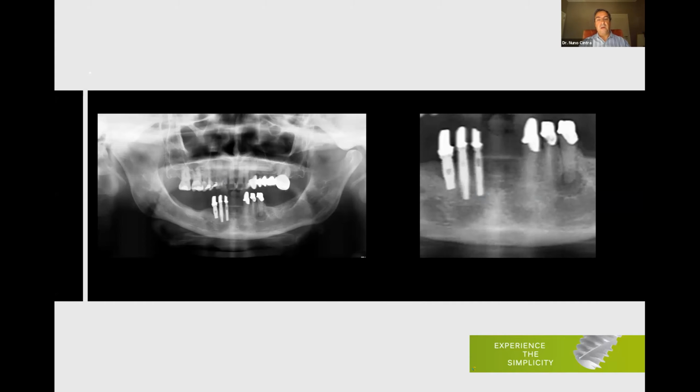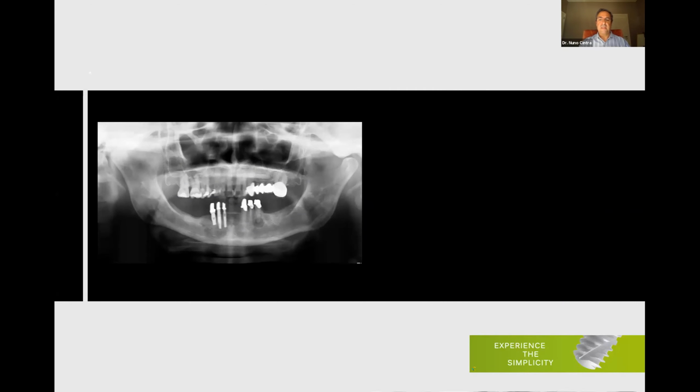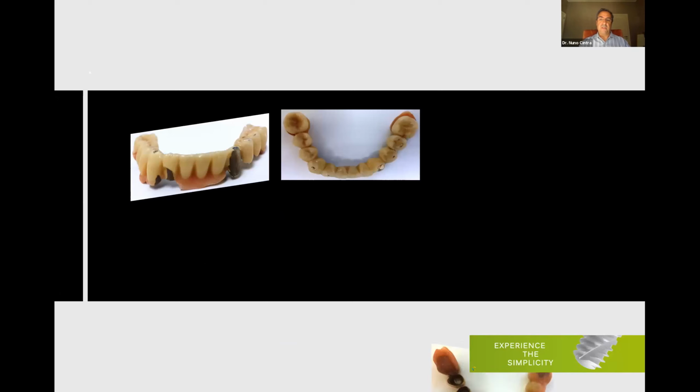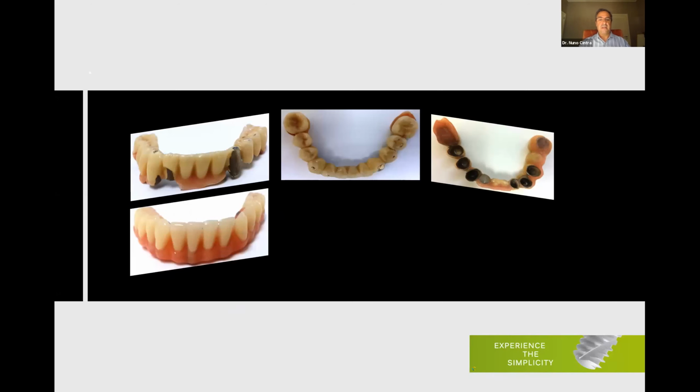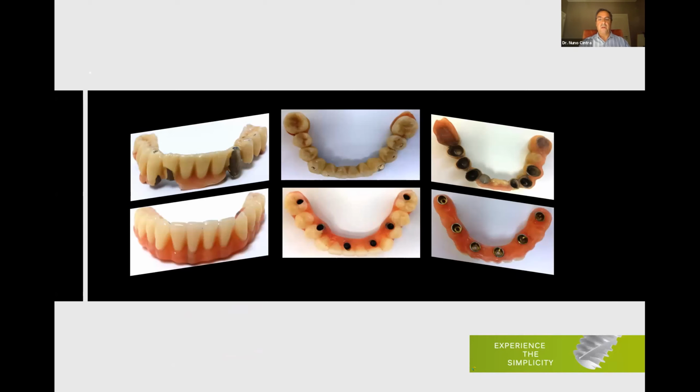And as you can see, over implants and over teeth, and the teeth were showing some problems. So we were able to place an all-on-6 because we had full bone volume. And we went from this to this with 6 implants. As you can see, the posterior ones are coming out on the 6, so we will have no cantilever or one tooth-in cantilever. So we went from this removable prosthesis that the patient had, to, on the same day of surgery, an immediate provisional bridge with the posterior implants coming out on the 6, as you can see.